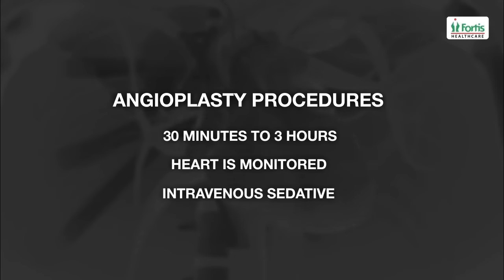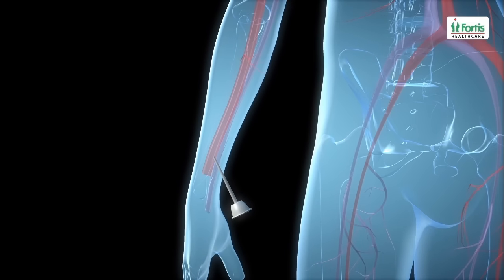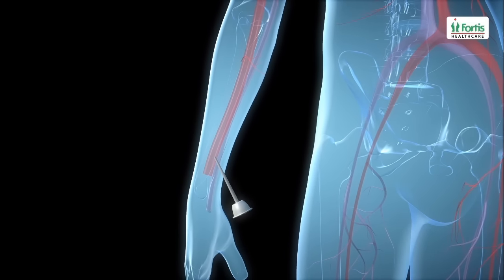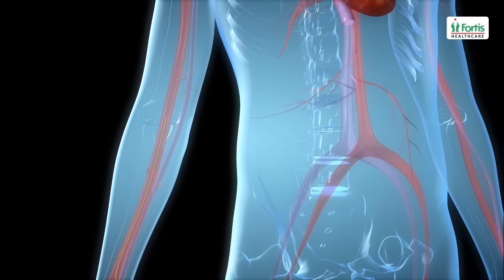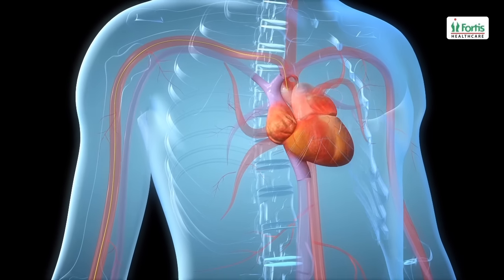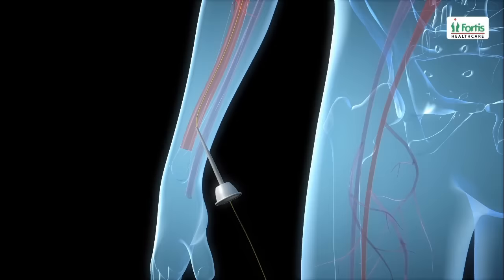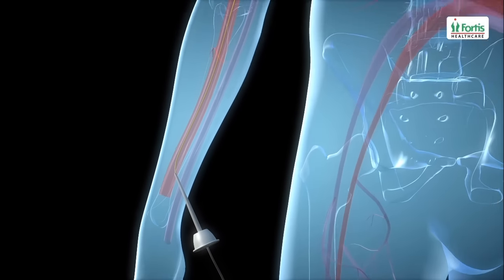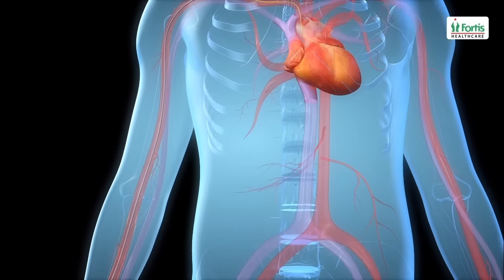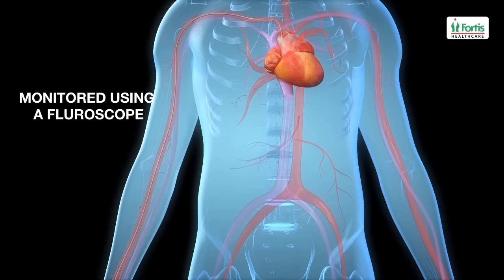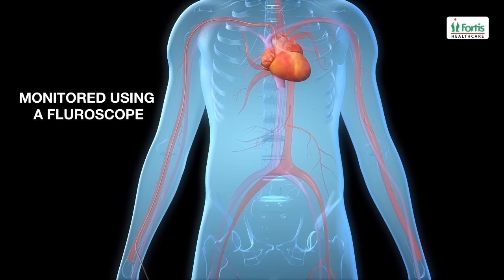To relax the body, a needle is inserted through the wrist into the radial artery. A guide wire is then passed through the needle and guided through the arterial system up to the heart. A flexible catheter is slipped over the wire and threaded up to the heart, monitored using a continuous X-ray imaging device called a fluoroscope.